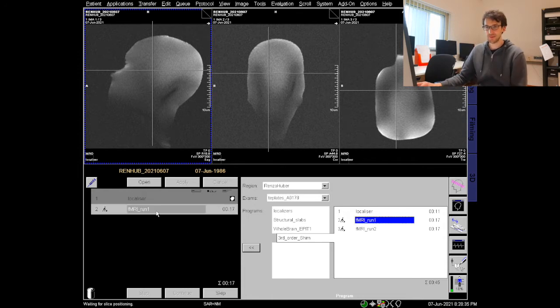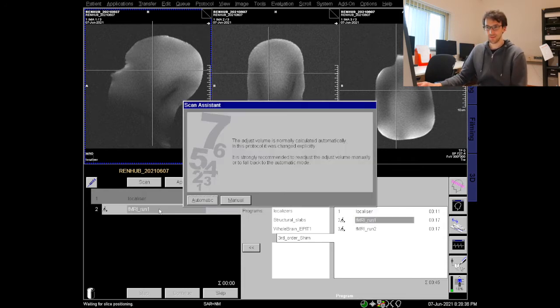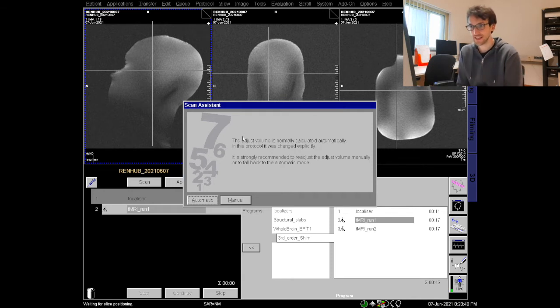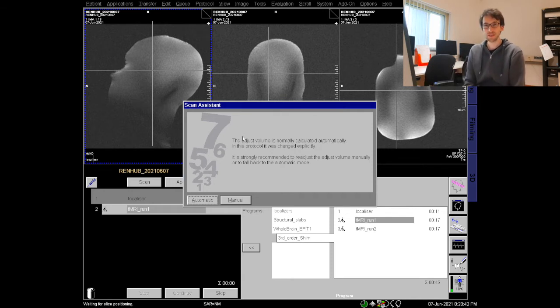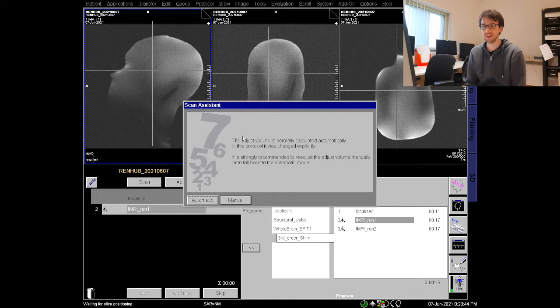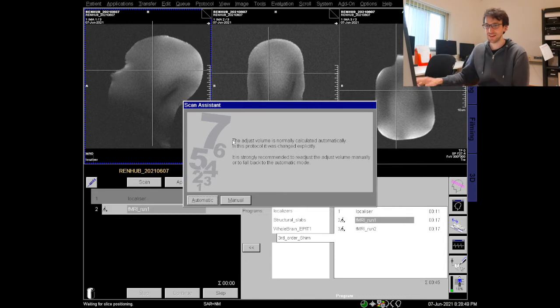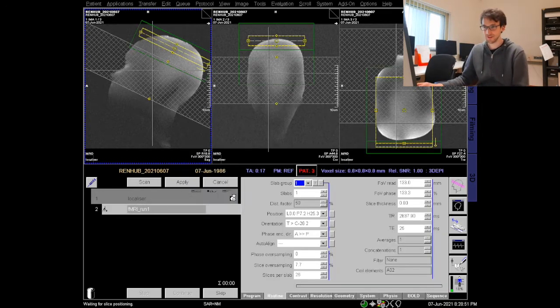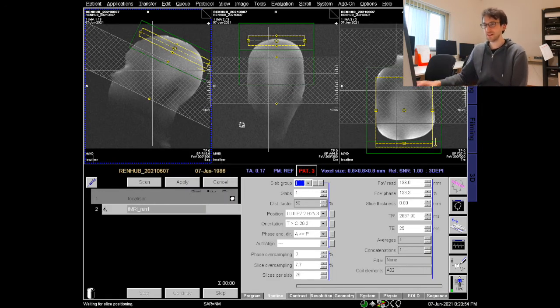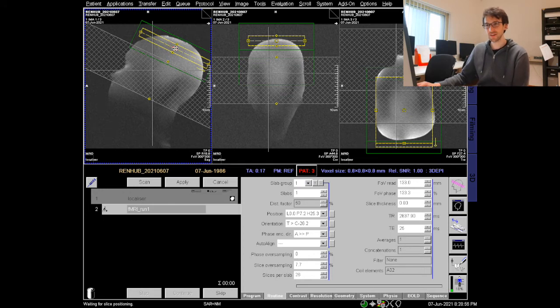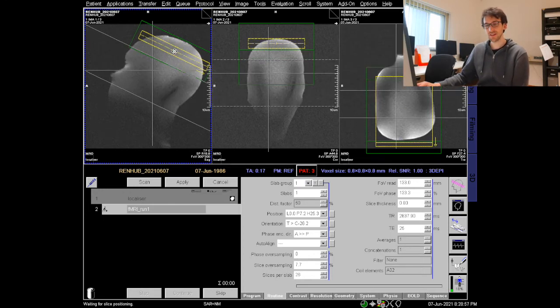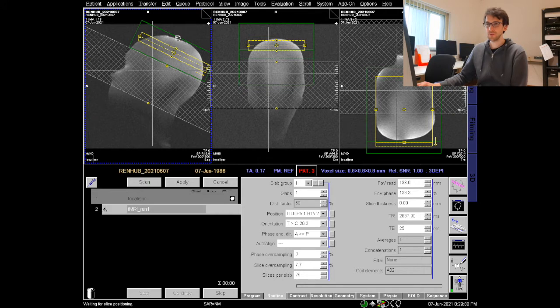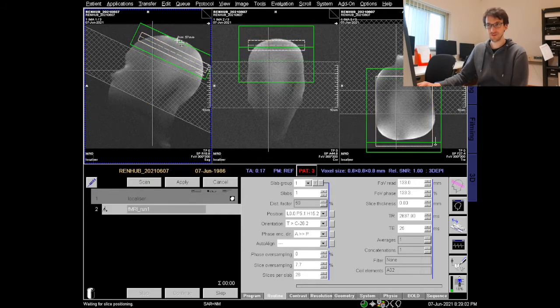Here for example if I double click that one and it asks me for the scanner system what I want to do, I always want to select manual, specifically when I use advanced shimming tools. Never click automatic, weird things happen. Use manual and then we can adjust our region of interest.